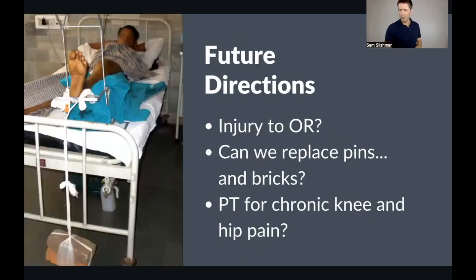All right. And future directions. So I very much want this product to be thought about in hospital as well. As it is right now, it is viewed as a pre-hospital device. You apply it in the ambulance. Patients get sent into the emergency department. If you find me, I'm going to leave it on.